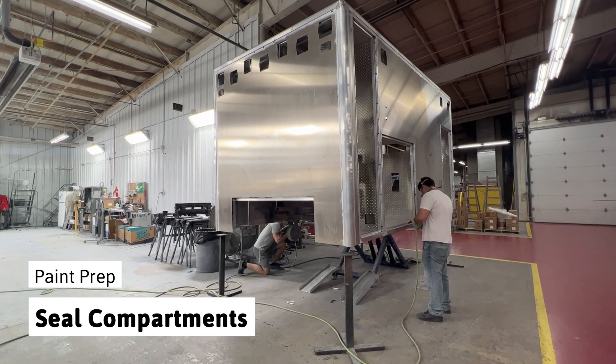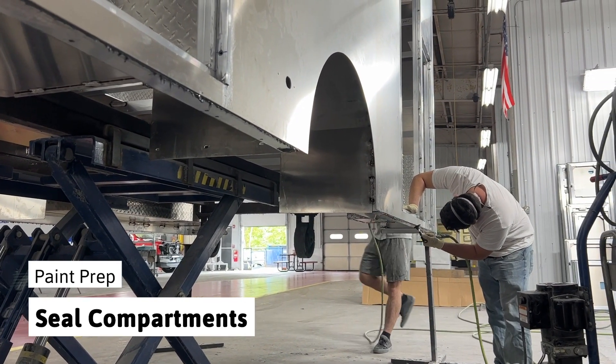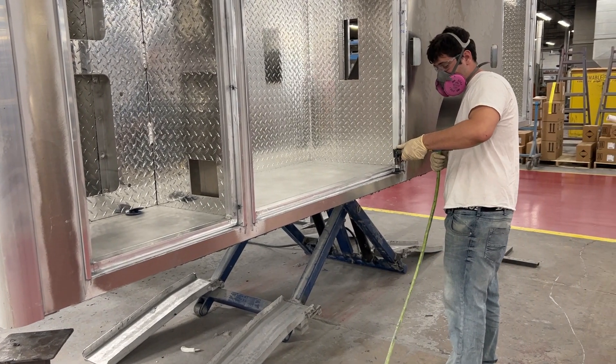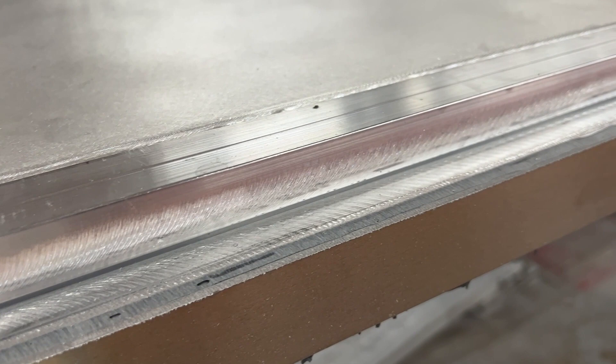After the ambulance body is fabricated, it moves to the paint prep area. You can see the ambulance fabrication process in a previous video on our YouTube channel. The compartment edges on the newly constructed body are sanded to create a better surface for the sealer to adhere to.